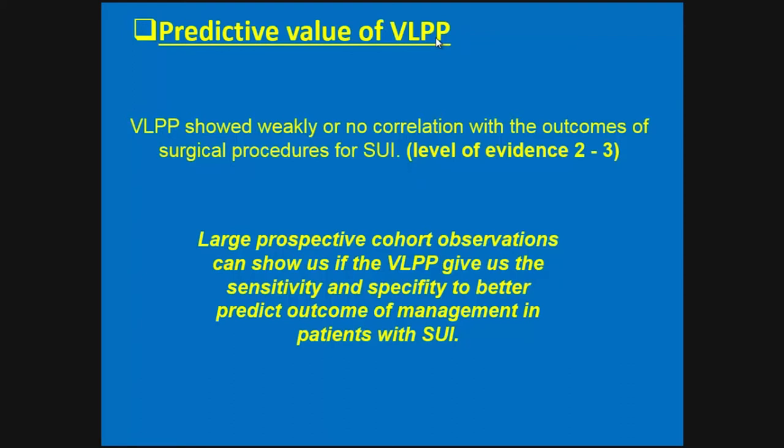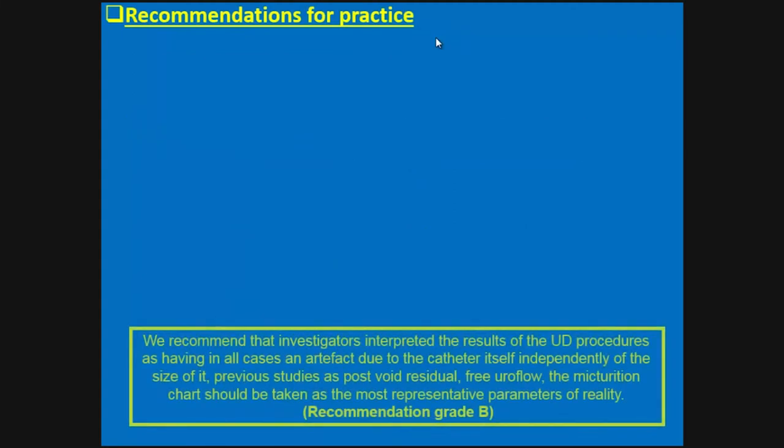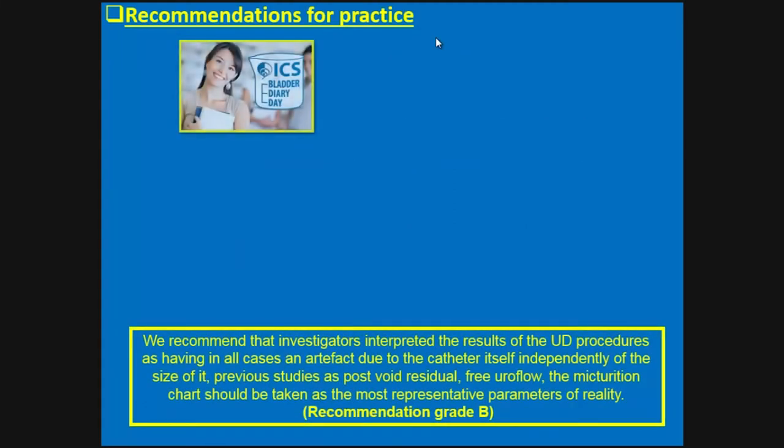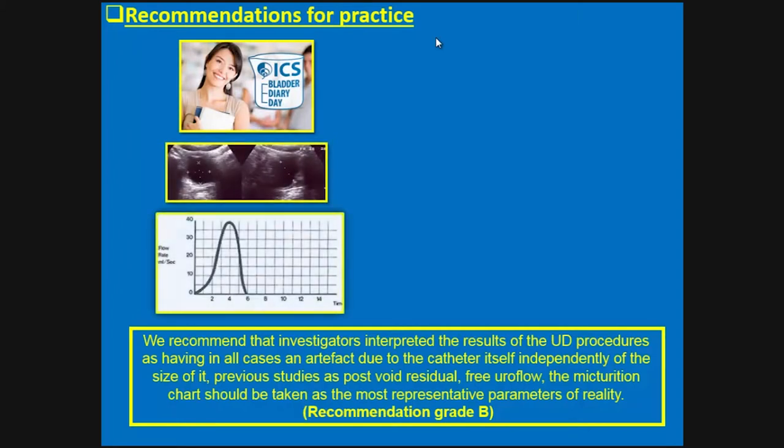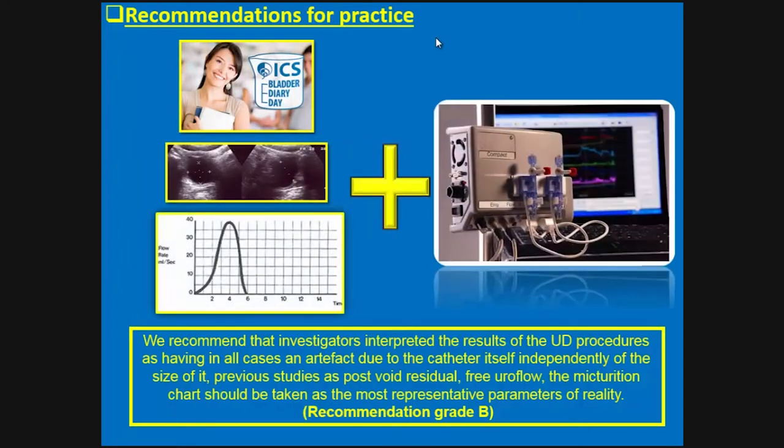So large prospective cohort observations can show us the real value of the Valsalva leak point pressure and its sensitivity and specificity to better predict outcome and management in patients with stress urinary incontinence. We do have some recommendations for practice. We recommend that investigators interpret the results of urodynamic procedures as having in all cases an artifact due to the catheter itself, independently of its size.